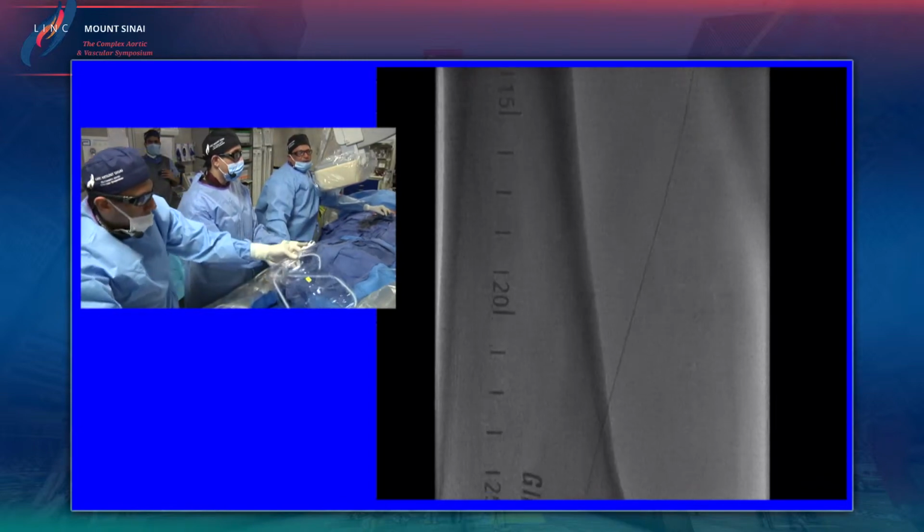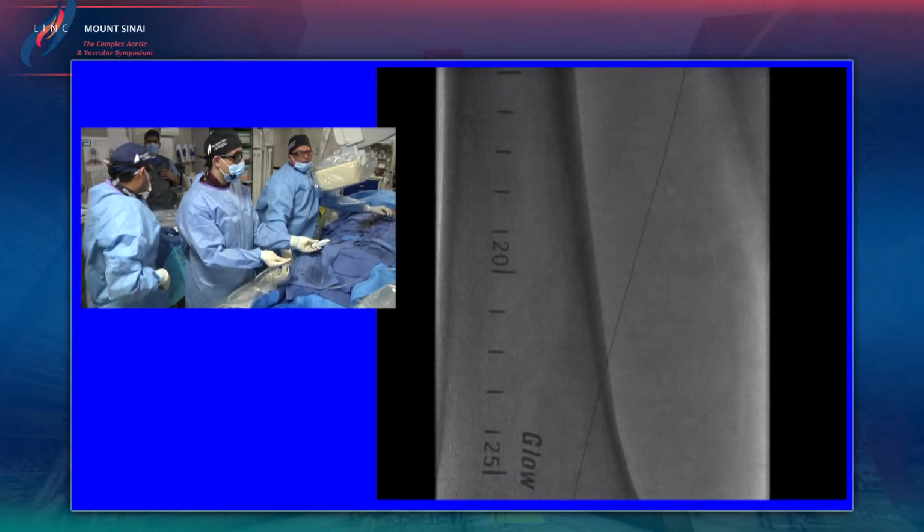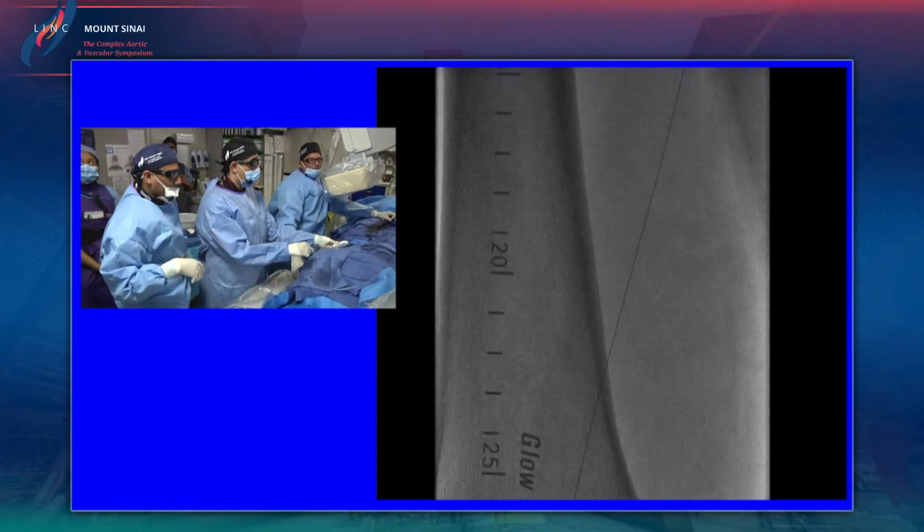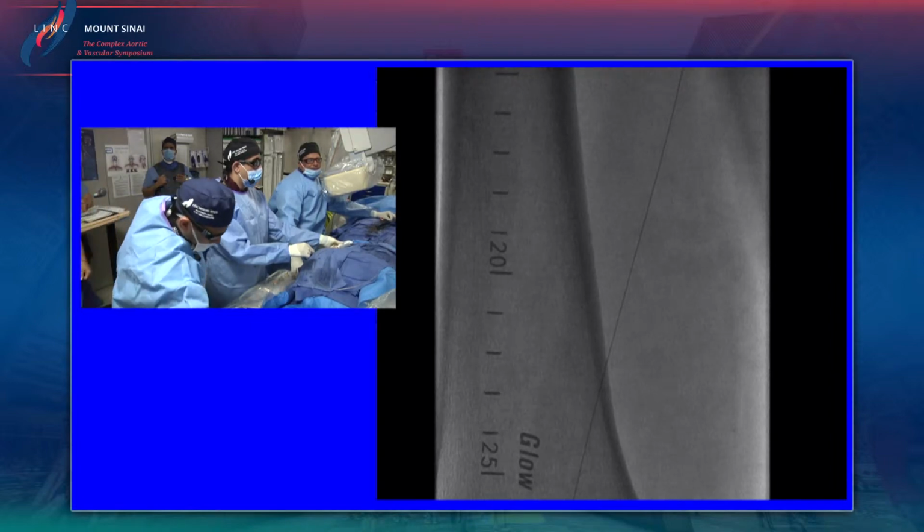Did you hear that question? How do you guys stent within the Supera? When you do another stent, do you stent or you just balloon the Supera and leave it alone? How do you deal with the sizing of the nitinol stent with Supera?